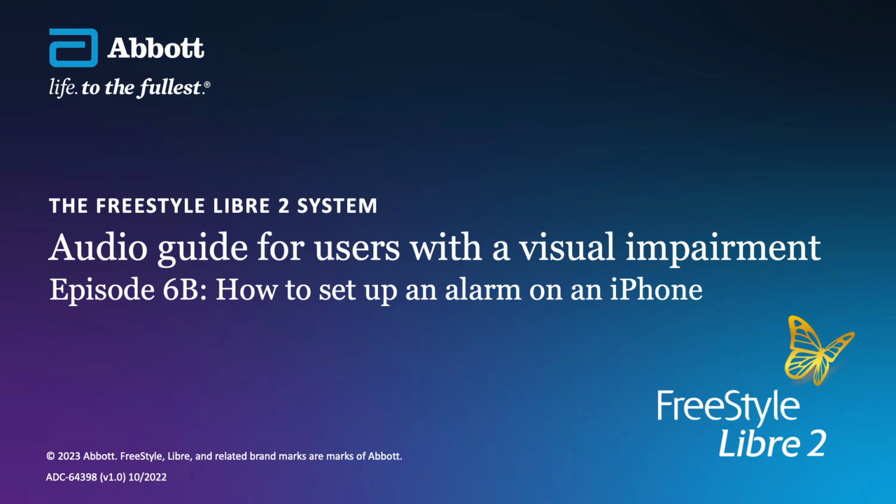Signal loss alarm. Selecting the signal loss alarm option will take you to the signal loss alarm screen. At the top of this screen and to the right-hand side is a switch button, off. Selecting this will turn the signal loss alarm on. The signal loss alarm will notify you if your phone loses Bluetooth contact with the sensor for a period of more than 20 minutes. There are alarm tone and override options available on this screen, the same as on the glucose alarm screens. You're all set.